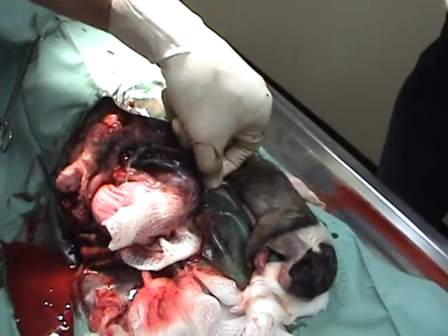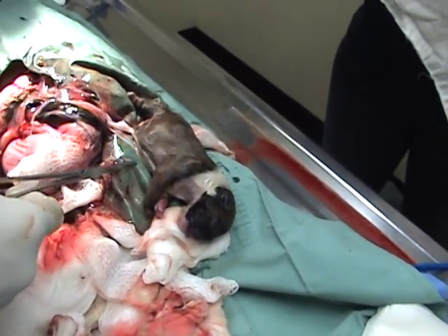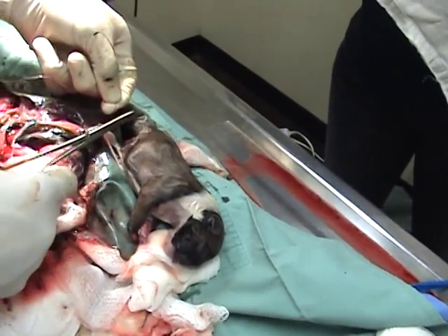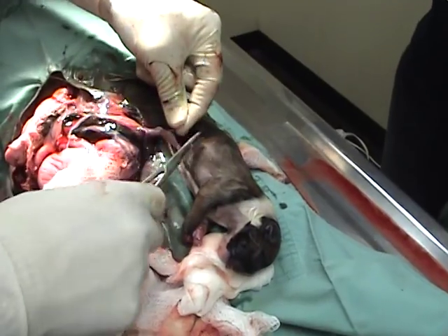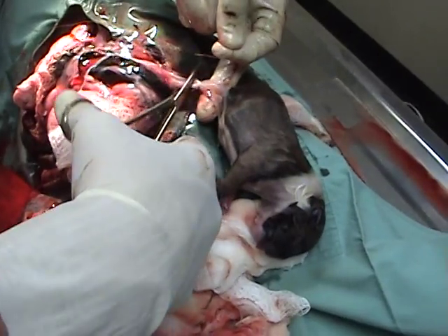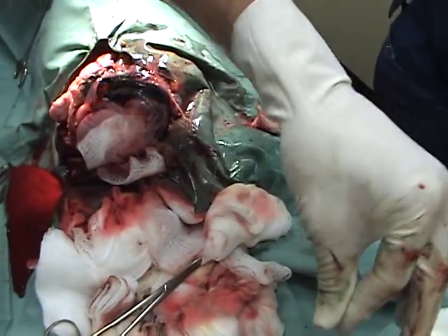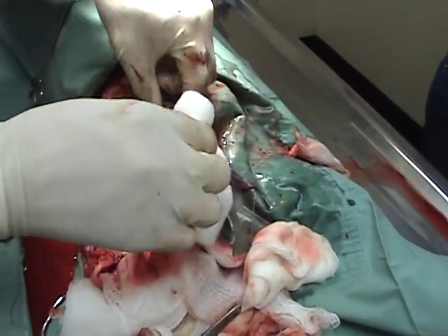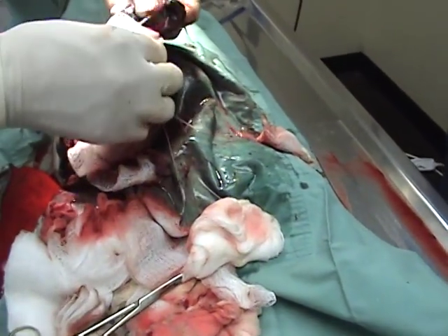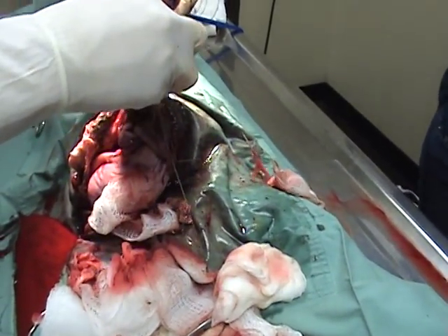It looks like an awful mess at the moment but that gets tidied up here pretty quick. Do you ever have people come in here and get squeamish? Do you typically let customers come back if they want to? Yes — so we're not special then? We thought we were special. Some people are squeamish; if they are, they don't come in, they just freak out. One thing you don't want to do is start pointing with your finger and touching things because that's a sterile field. It's all been cleaned up, gloves are on, and you don't even want to be shaking your head over it and getting hairs in there.